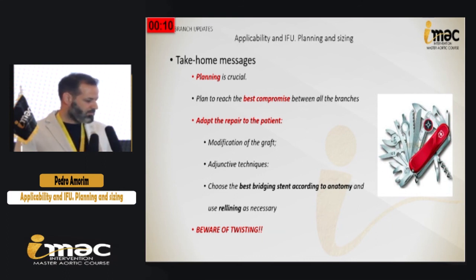We almost always reline and play a little bit with the armamentarium of the bridging stents and be aware of twisting. That's what can be a mess in the procedure, the twisting.